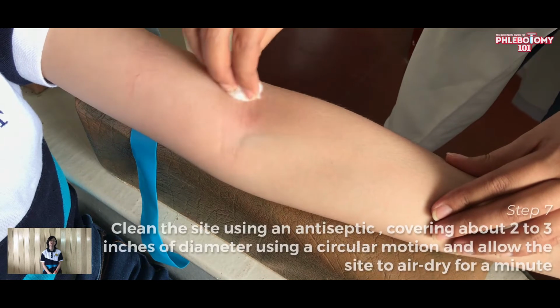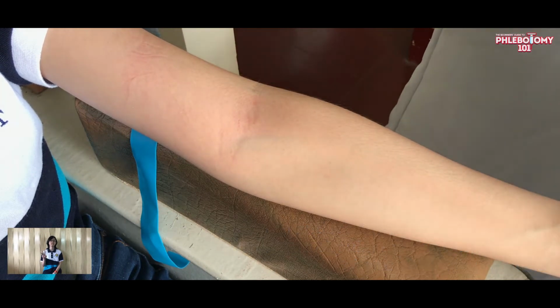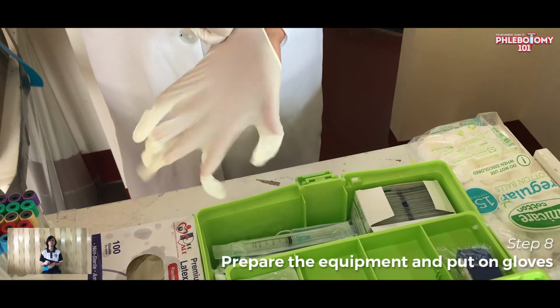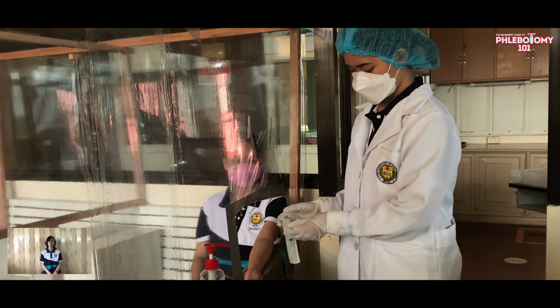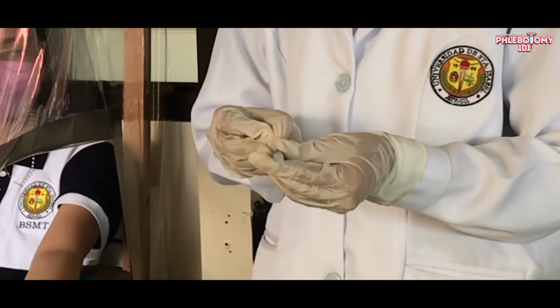Step 7 is to clean the site using an antiseptic, covering about 2 to 3 inches of diameter using a circular motion, and allow the site to air dry for about a minute. Step 8 is to prepare the equipment and put on gloves. In this video, we will be doing the venipuncture procedure using the syringe system, so it is very important to select the appropriate syringe and needle. Open the package aseptically and securely attach the needle to the syringe, and then you have to test the plunger.